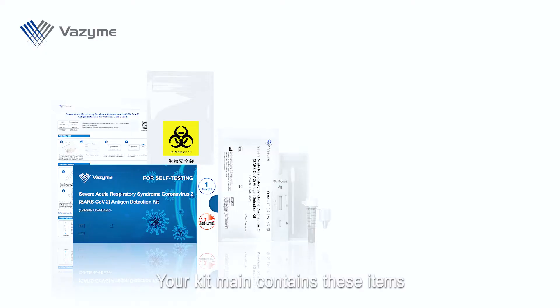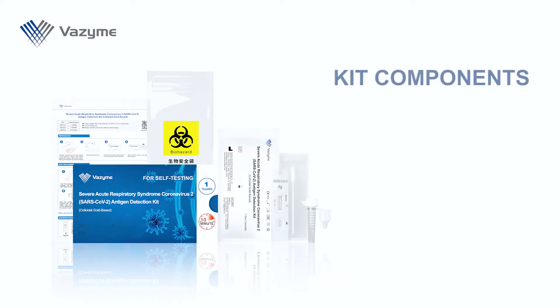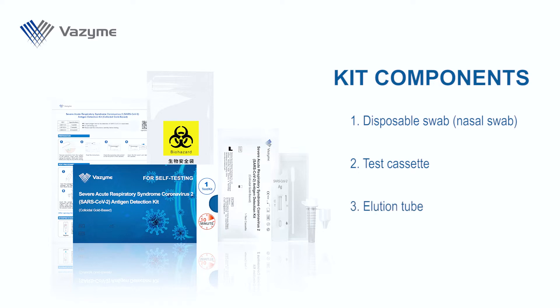Your kit may contain these items: disposable swab, nasal swab, test cassette, elution tube, and instruction for use (IFU).